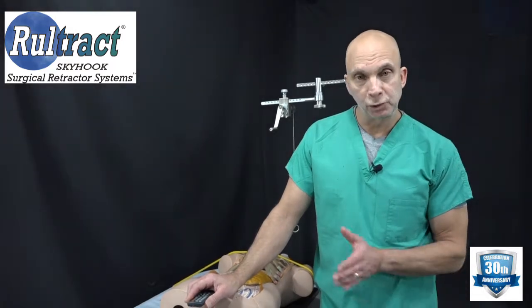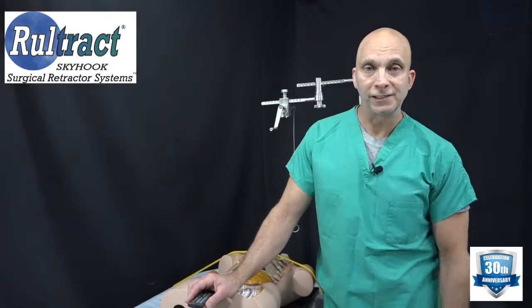That completes the setup instructions for our thoracic set. If you have any questions, please contact me by email or phone.